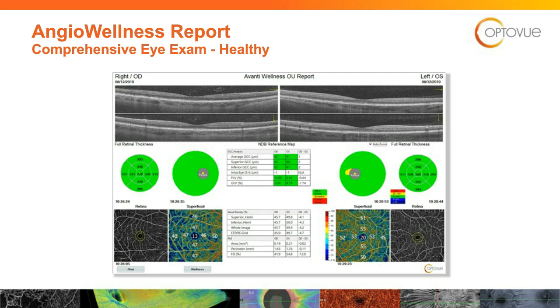I've looked at these enough that the inner circle there should be around 46 to 53, and then high 40s, low 50s in that outer ring. And then it's always thicker nasally than temporal, as it's depicting there on both of those patients. So that's about as long as it takes to go over it with a patient, and obviously there's some questions on it.